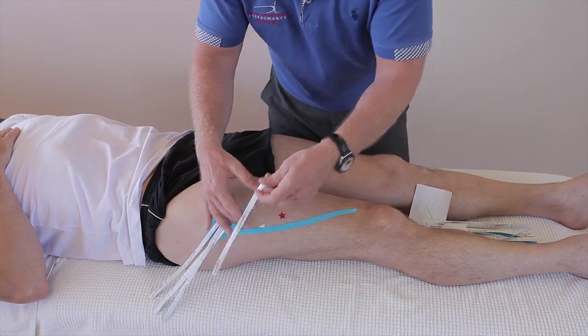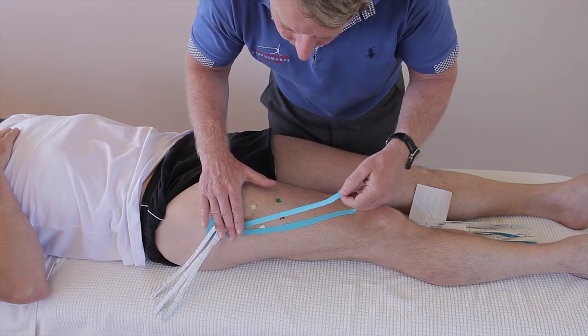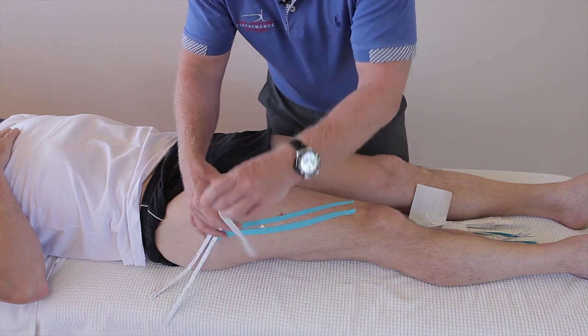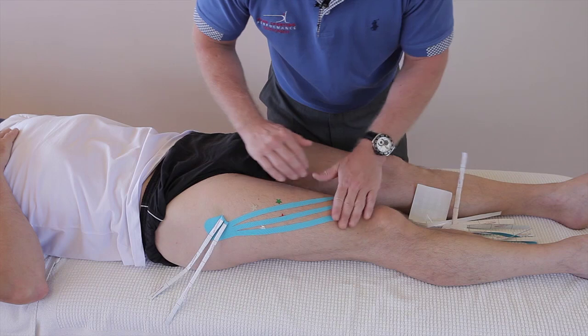I've seen swelling so bad that the knee is actually swollen as a result of a quadricep tear. Leave a little gap in between each one, and then the third finger like so.